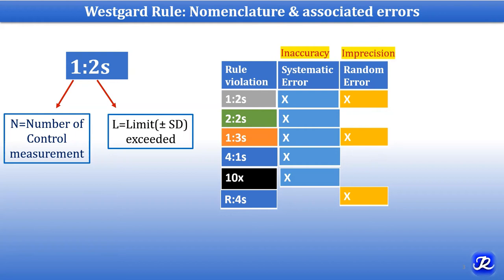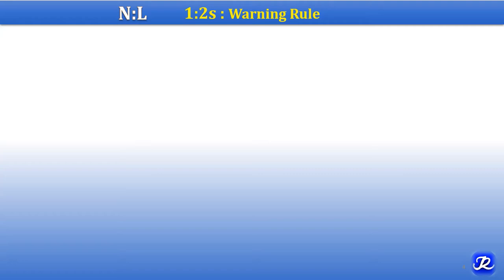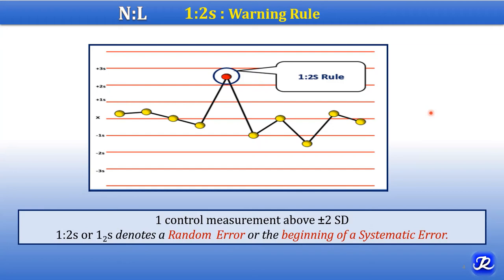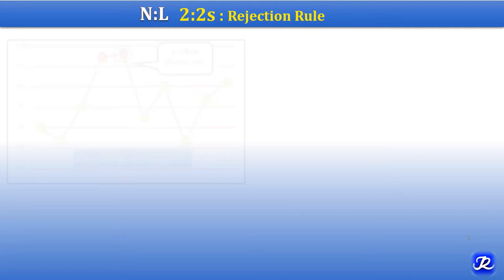Systematic error is representative of inaccuracy, and random error represents imprecision. Now let's understand each rule. In the 1-2S rule, this Levy-Jennings chart is created with mean ±1, 2, and 3 standard deviations. In the fifth run, you can see that this control measurement is above 2 standard deviations — it is violating the 1-2S rule. One control measurement above ±2 standard deviations is the 1-2S rule, which denotes random error or the beginning of systematic error.